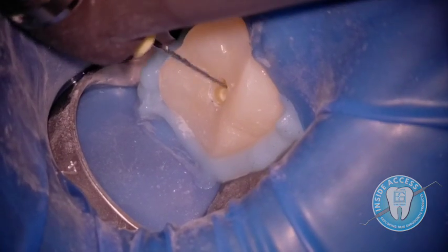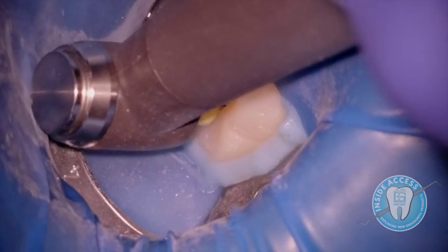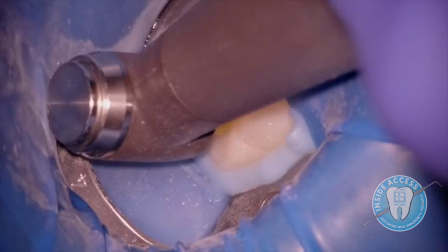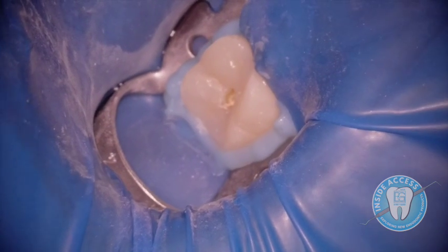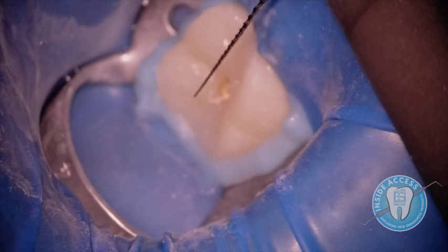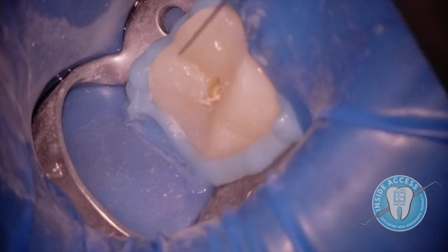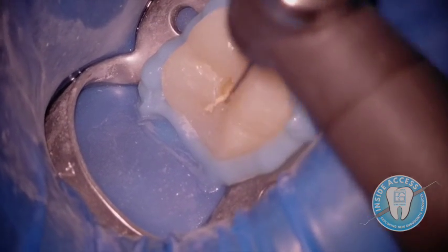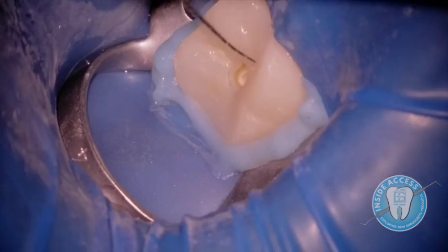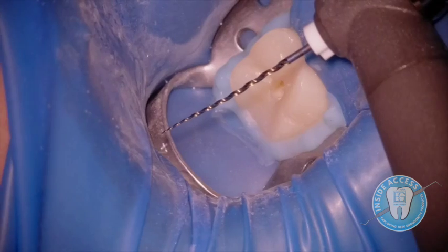Here's the glide path file at 14/03, still at 1000 RPM — gentle touch, just allowing it to engage into the GP and it operates very nicely for this purpose. You can see some GP coming up. Here's S1 at 17/03. At this point I'm going back to 500 RPM, which I prefer for these files. I find them to perform very well at 500 RPM. You can see the corkscrew nature of how the GP is removed.